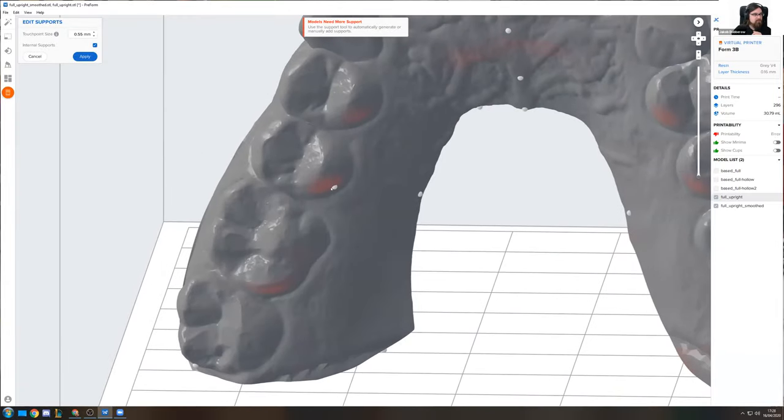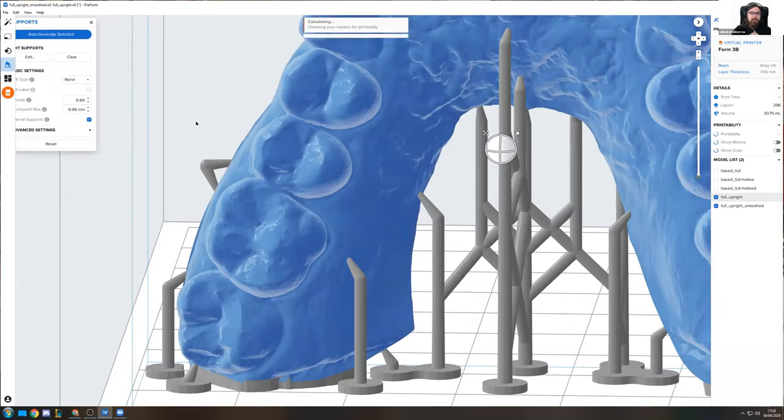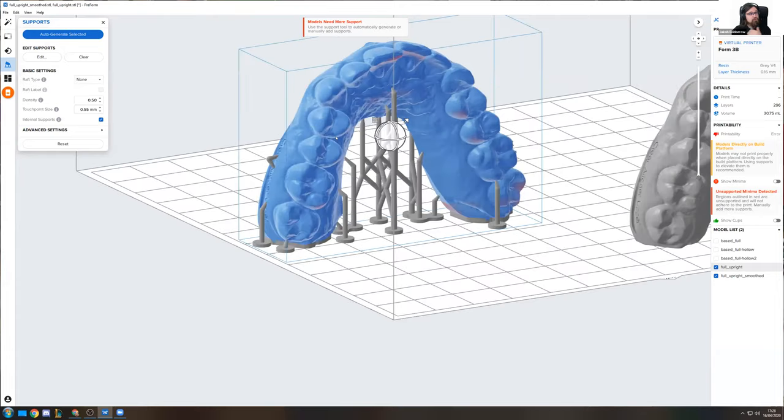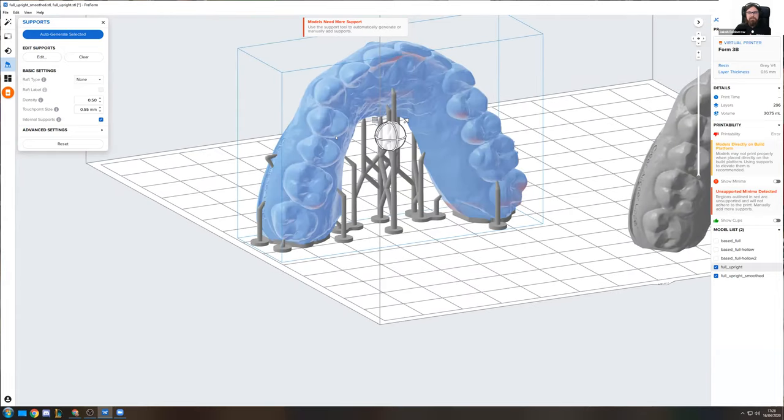And then this red shaded area here, of course, I don't want to put my support in here to have this be solved, but maybe I can put it somewhere here where it's printing earlier, and then it helps me get rid of this red shaded area. And seeing how much of a red shaded area you can ignore and where you should put in supports is also a thing that will come with experience. Yes, it would be nice if on your model there were no red shaded areas at all, but you can definitely print with a couple of red shaded areas.